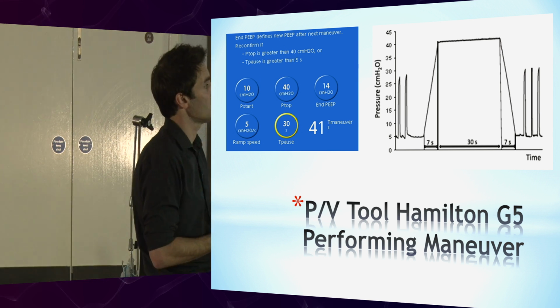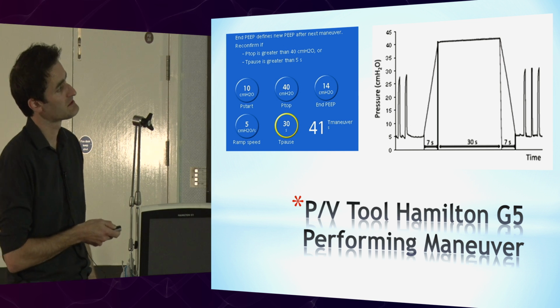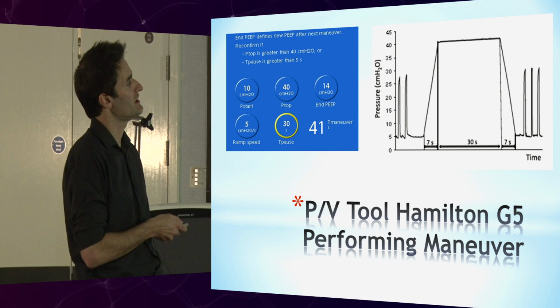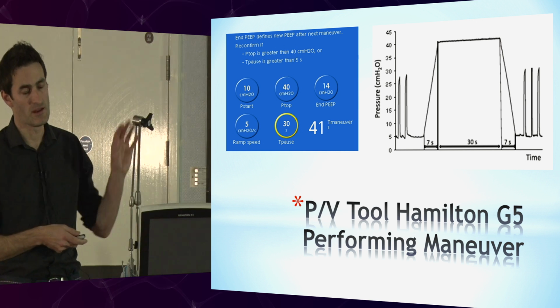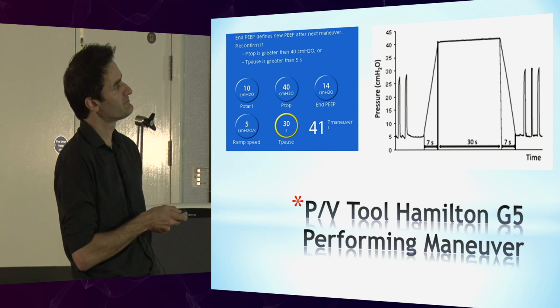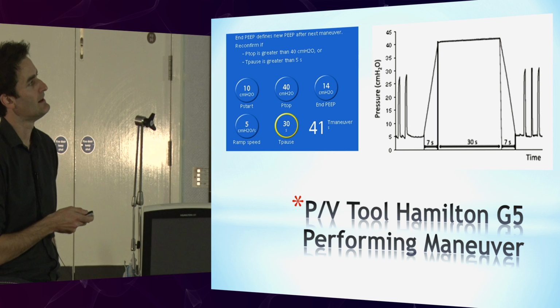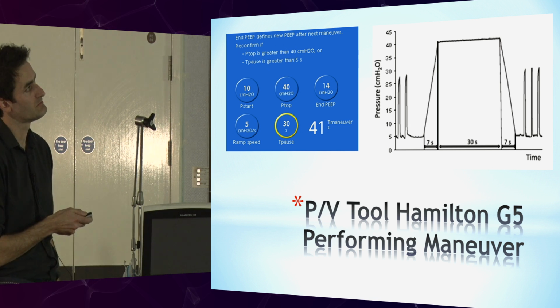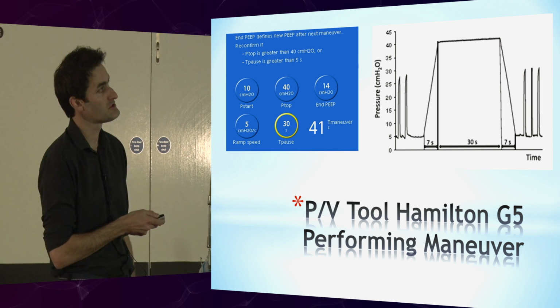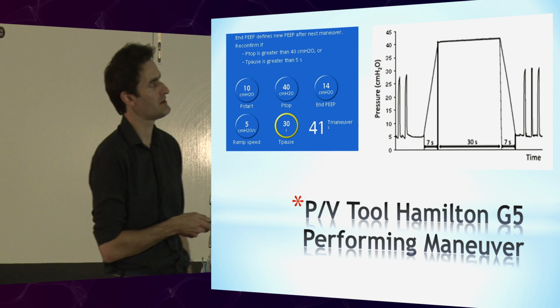So here you can see a curve there. So tidal ventilation here. This is where the manoeuvre starts. So this is where you ramp up the pressure. Okay, so we tend to use a ramp speed of 5. We'll talk about the numbers in the workshop. Up to your top pressure. So again, 40. We sometimes use 35, 40. And then hold it. Okay, and this is the time during which your recruitment should hopefully be happening. Then back down again. Okay, and tidal ventilation here.